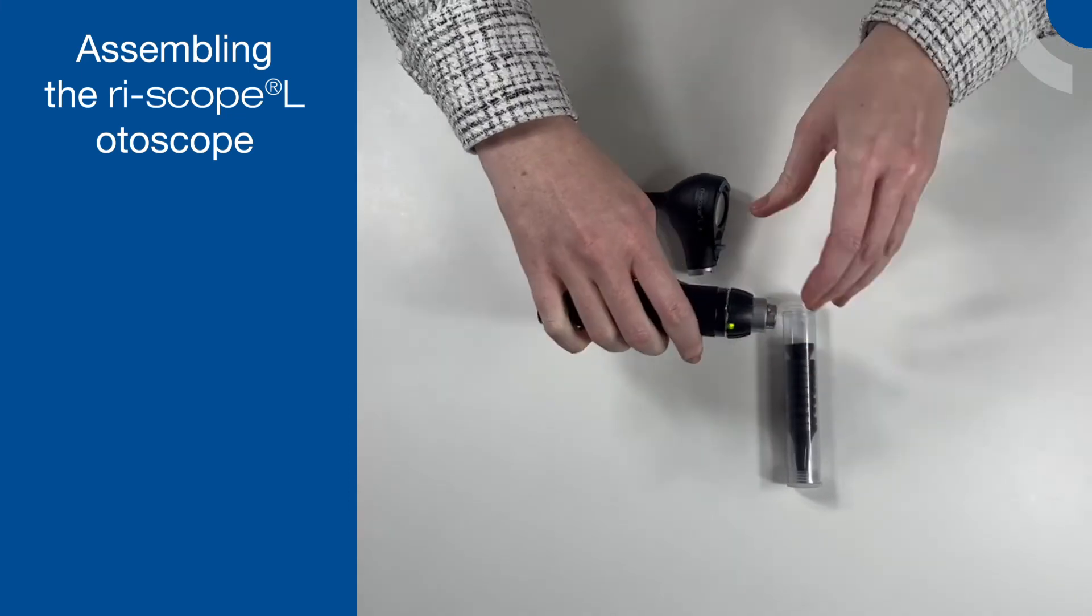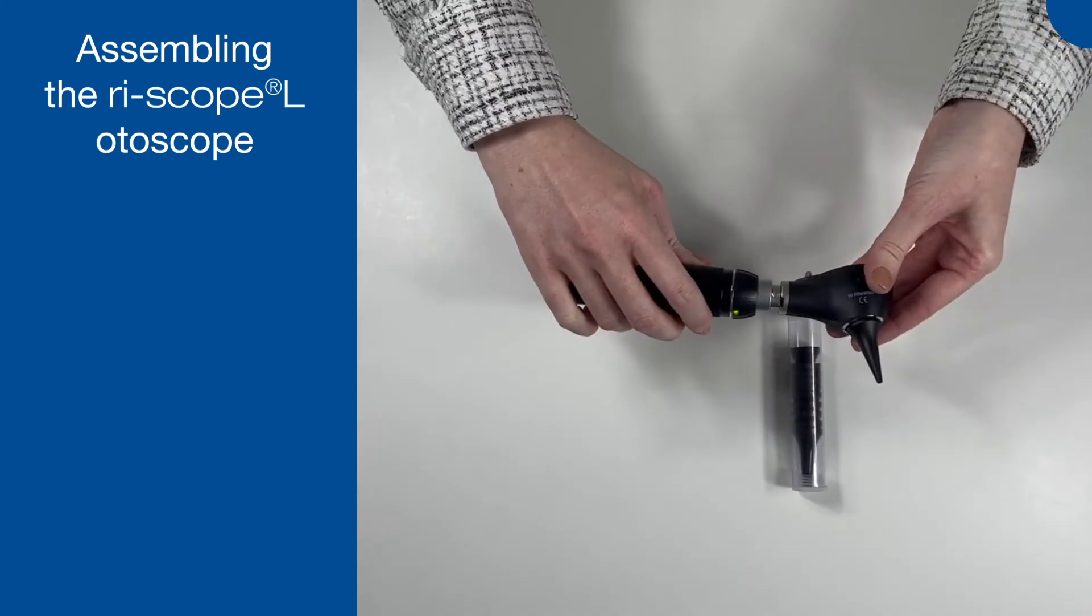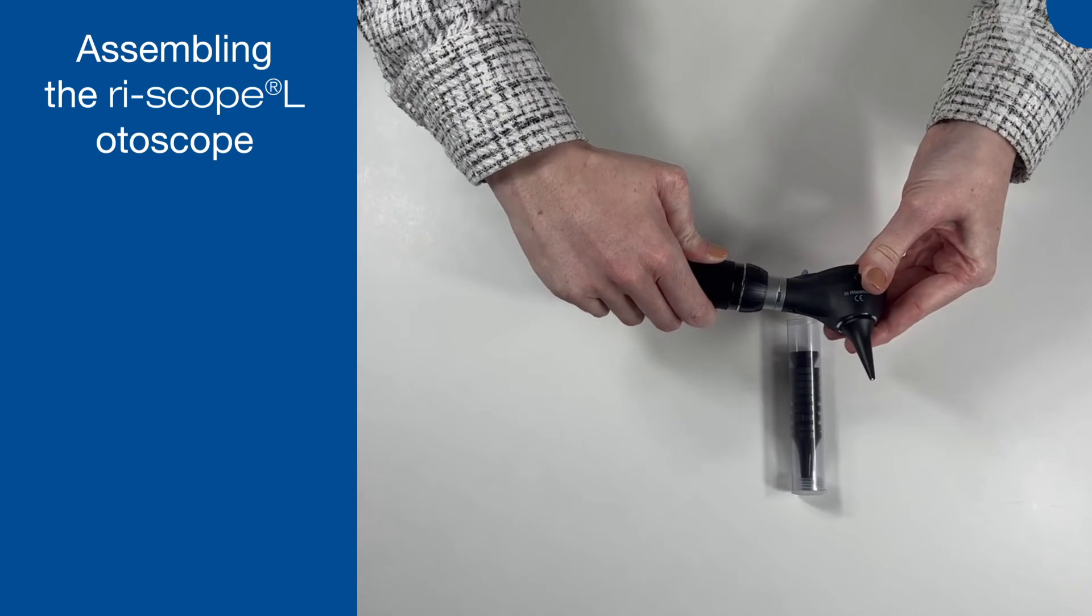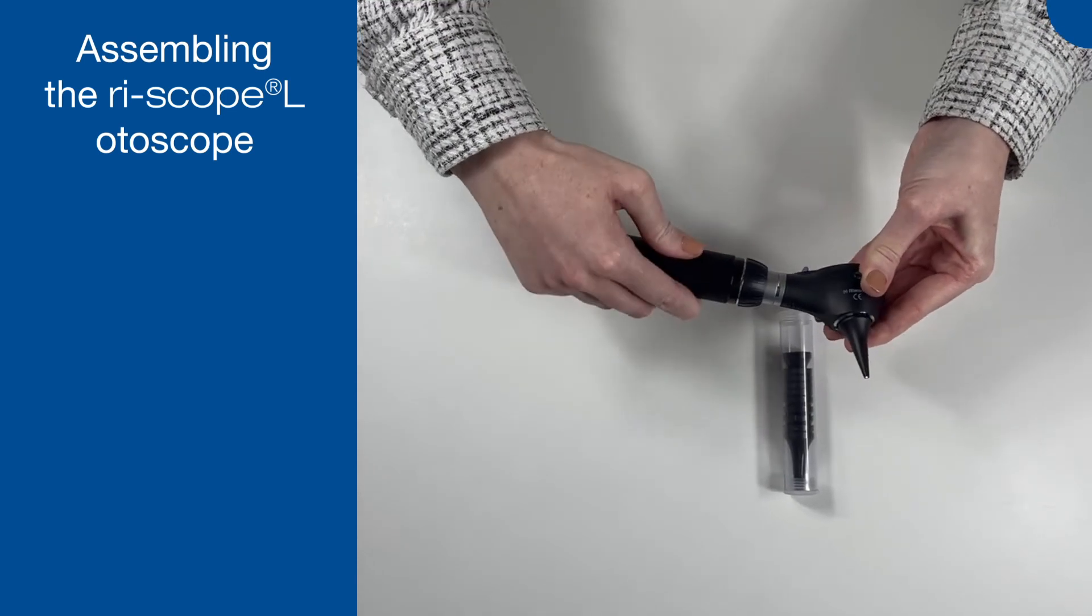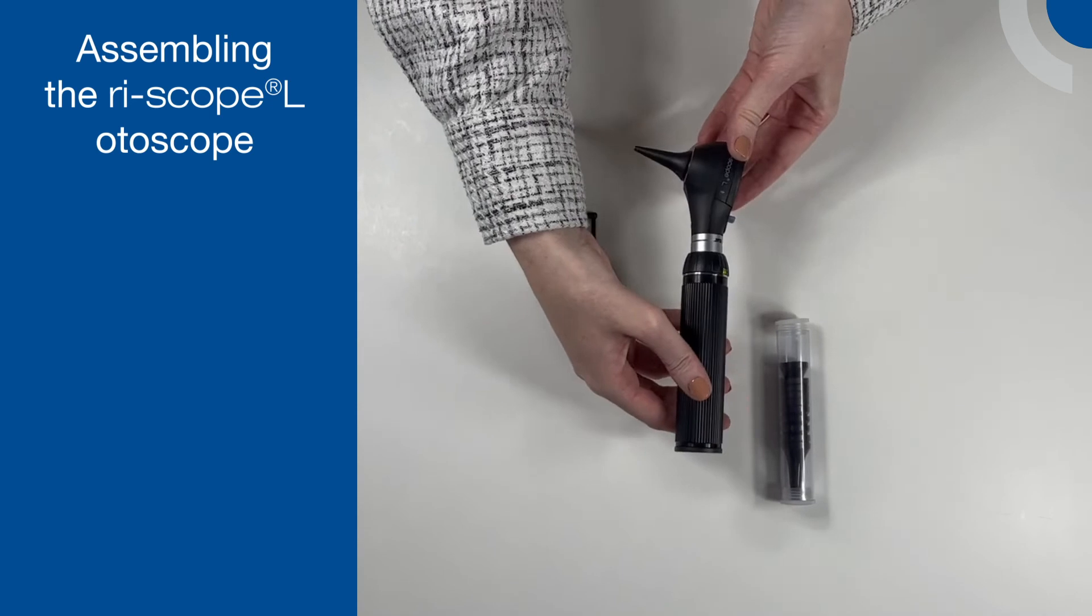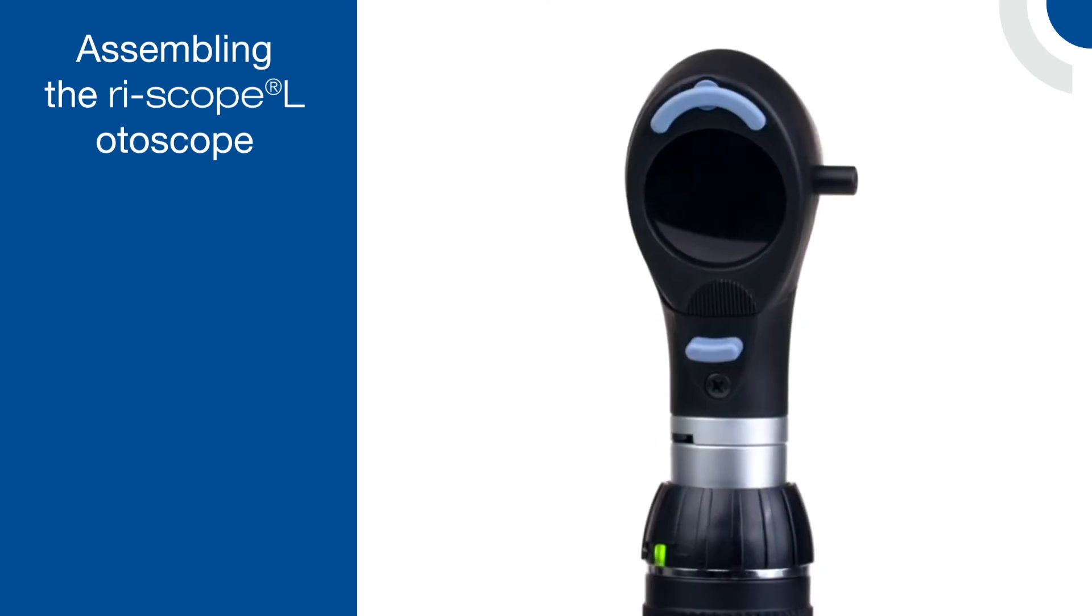To attach the L3 otoscope head, align the bayonet fitting of the otoscope with the bayonet fitting on the collar of the handle. Push the head down into the handle and turn clockwise until it locks. An audible click confirms it is secured.